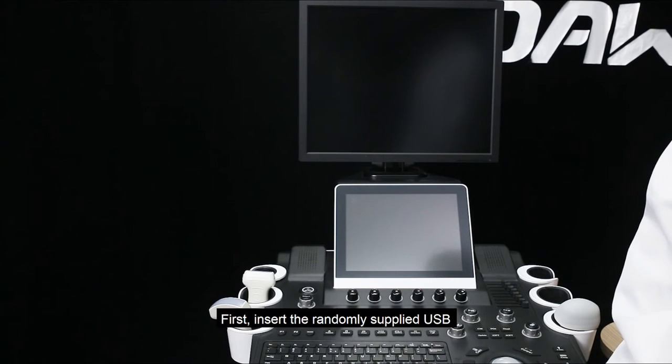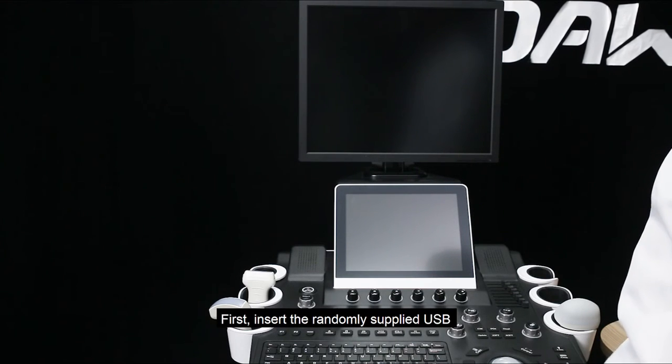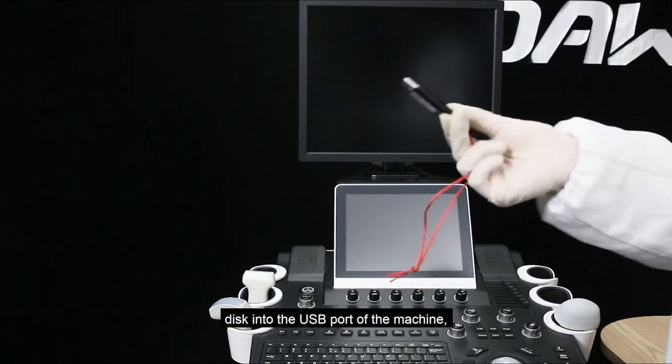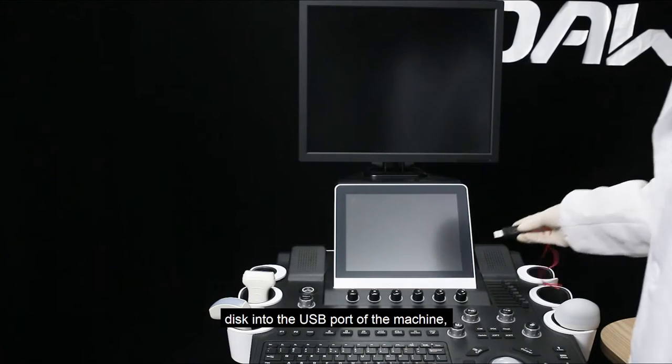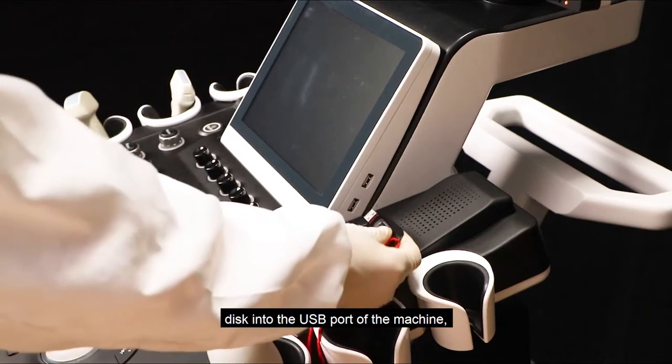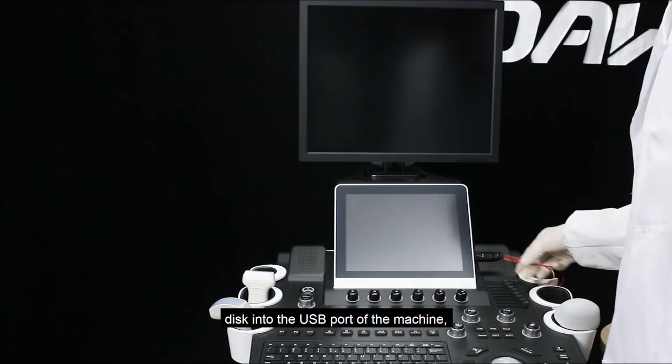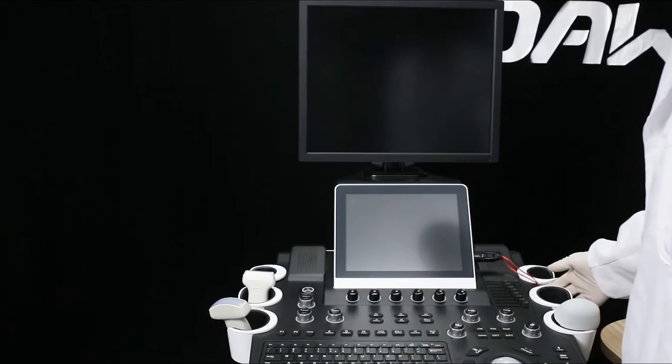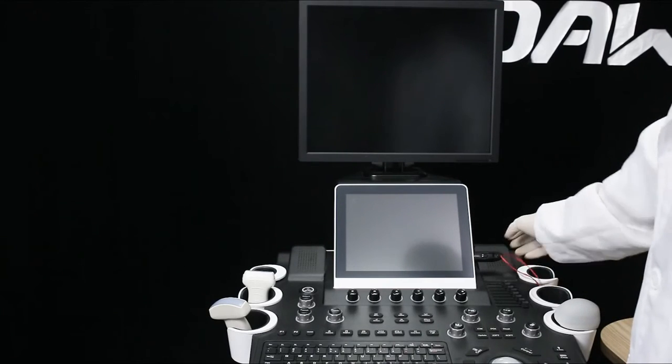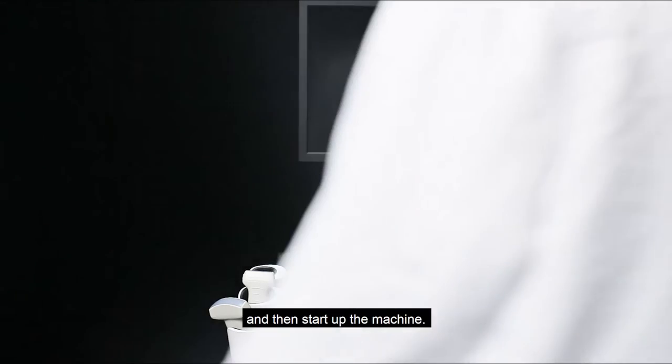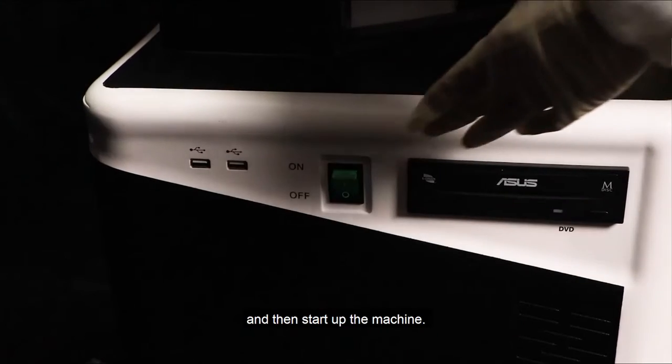First, insert the supplied USB disk into the USB port of the machine, and then start up the machine.